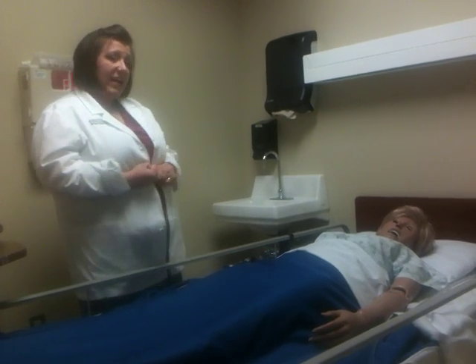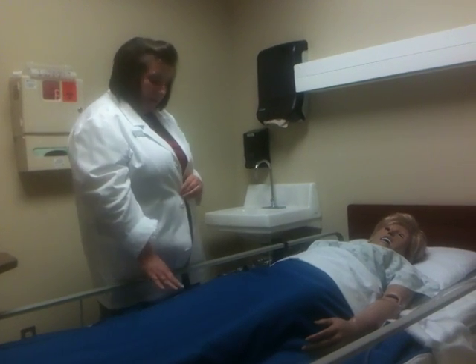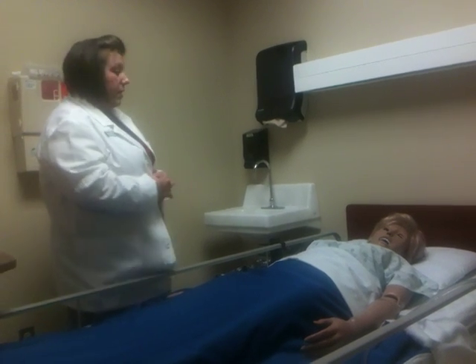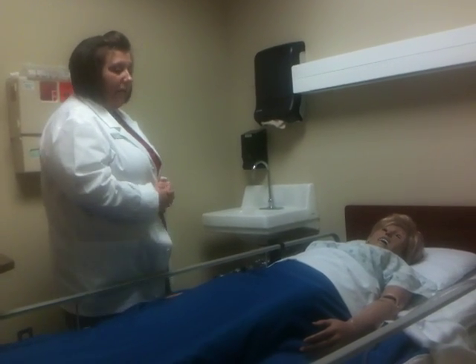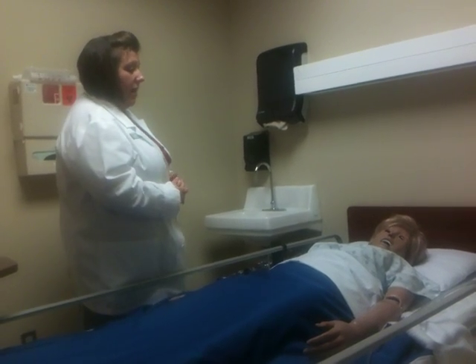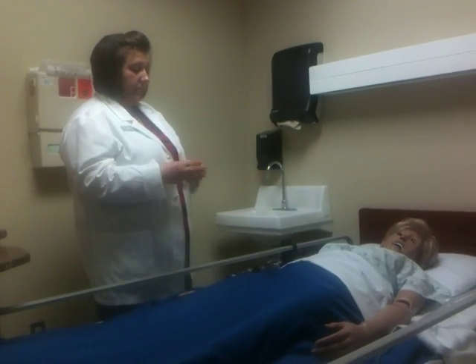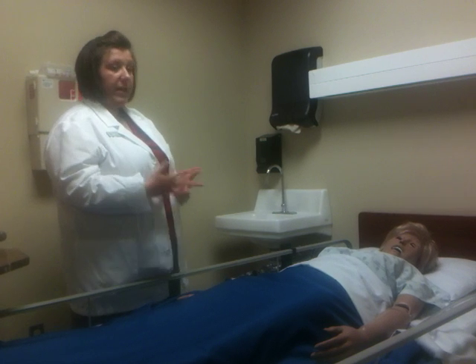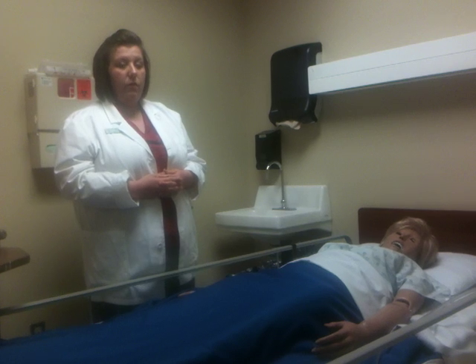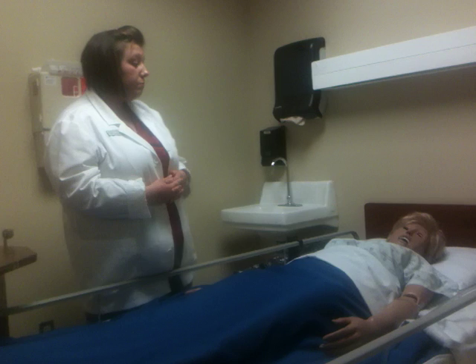Go ahead and perform your hand hygiene and identify your client. So ask your client their name and their date of birth. Check their armband. Okay. Ms. Smith, do you have any allergies to latex or tape? She tells you that. Have you ever had any kind of facial trauma or sinus surgeries or anything to your face? And she tells you yes or no. This is important because if she told you yes, you would want to verify with the healthcare provider before you insert this because of the risk.